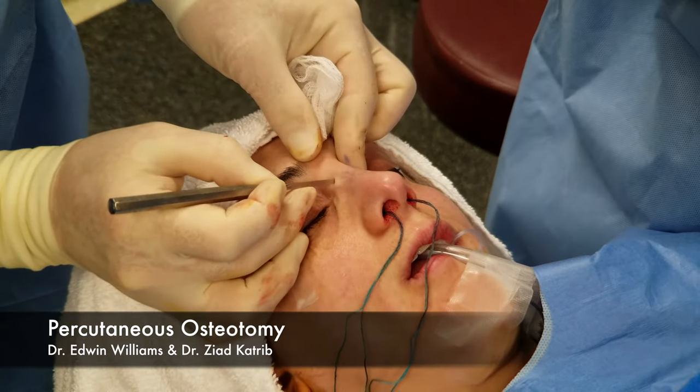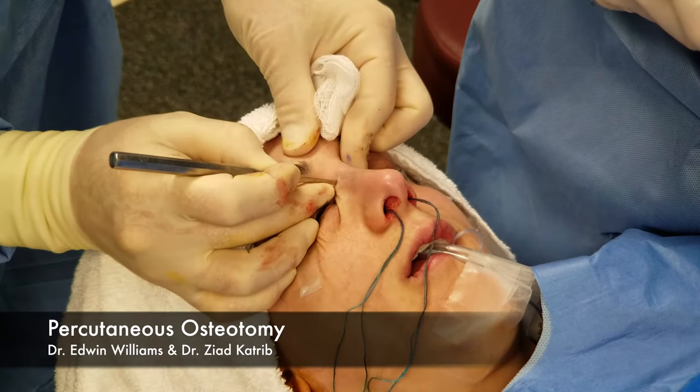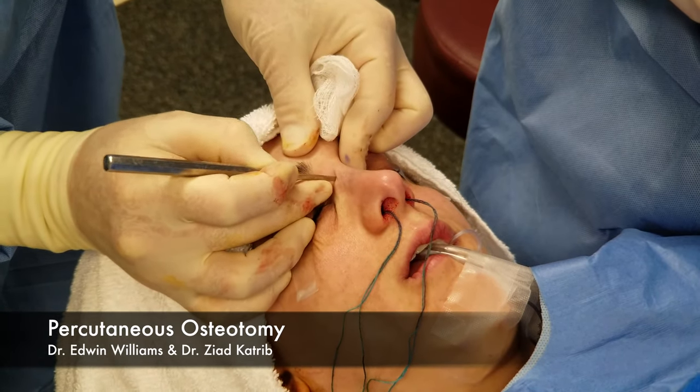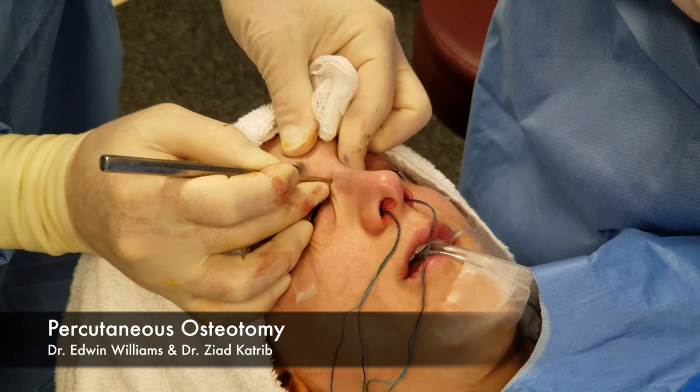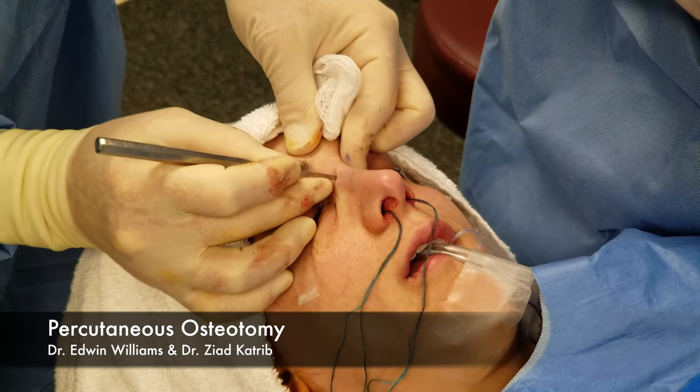I try to use a versatile location — right here — one good tap. We can move around here without putting a bunch of different percutaneous holes. Another advantage of the two millimeter is you don't even need to put a suture in it when you're done.